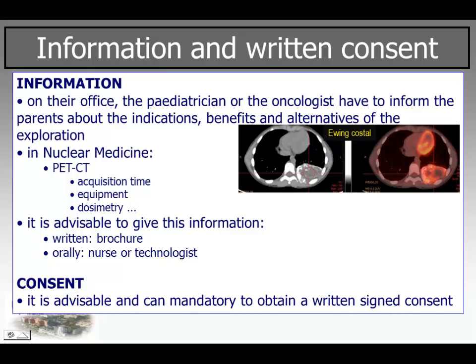And in our department, nuclear medicine, we have to inform them about the acquisition time, the equipment, the dosimetry, etc. It is advisable to give this information in a brochure and orally also by the nurse or the technologist. It is advisable, and in my country is mandatory, to obtain a written signed consent from the parents or the tutors.